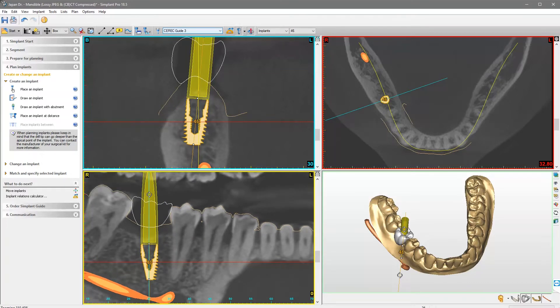To rotate the implant, position the mouse cursor on top of one of the two rotate icons that appear over the implant shoulder or below the implant apex. When using the former, the implant will rotate relative to the apex of the implant. If using the latter, the implant will rotate relative to the shoulder of the implant. Click and hold the left mouse button and move the mouse to rotate the implant.